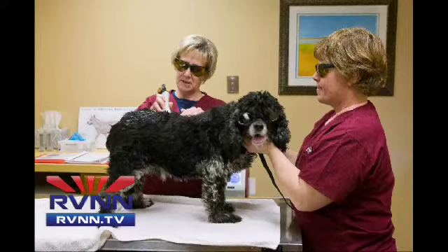Okay. So what does this look like? Do you have to shave the animal? No, you don't have to shave them. Actually, we have a picture of what it looks like to have laser therapy. You do have to wear protective eyewear. It's a class 4 laser. So the dog and the animals have to wear protective eyewear too.